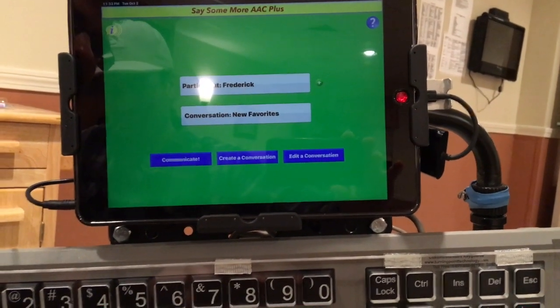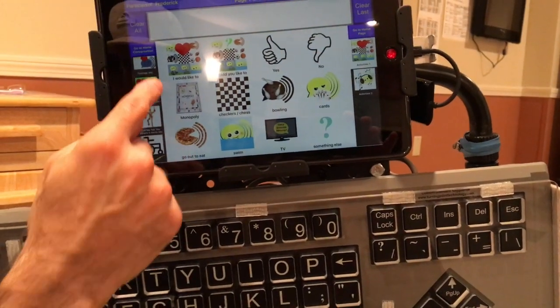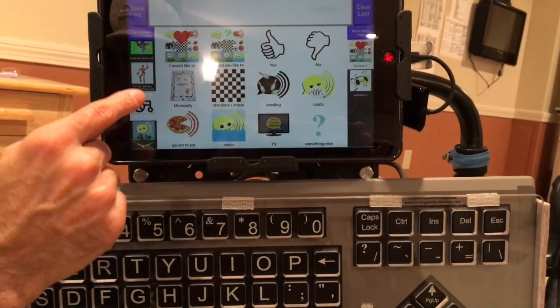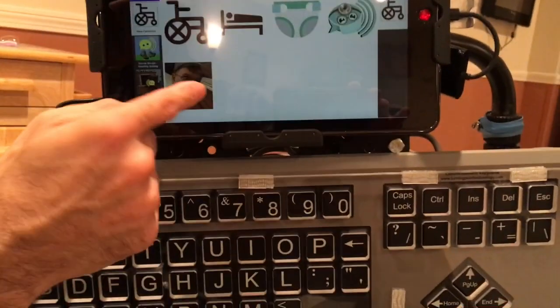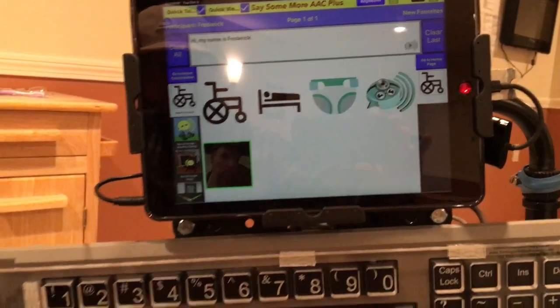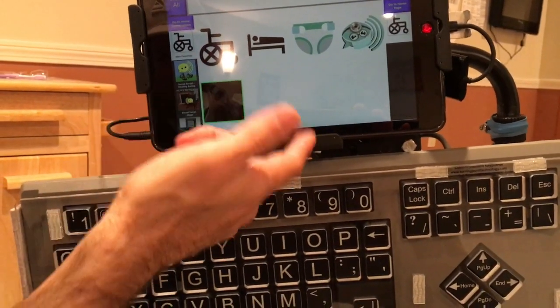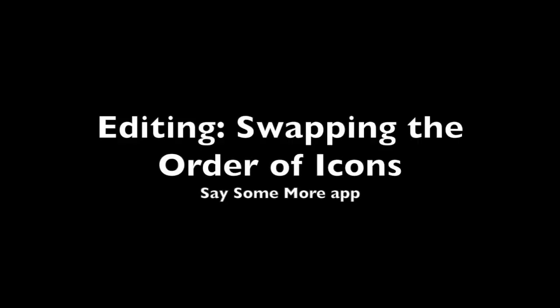All right, so it added a new icon to that conversation. We're gonna go to communicate. We're gonna scroll down to new favorites. Here it is. Let's see if it works. Hi, my name is Frederick. That's how you add a new conversation, a new icon in an existing conversation by editing it.